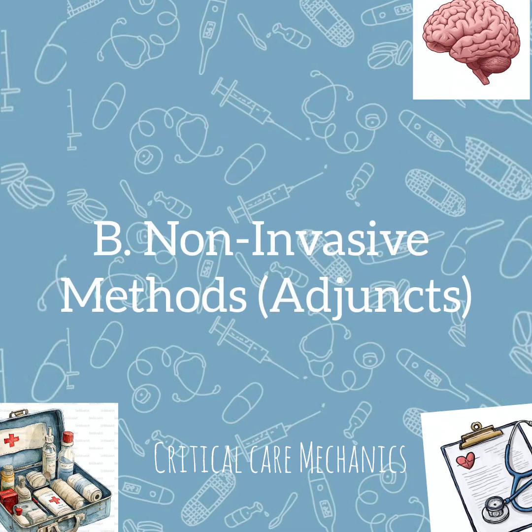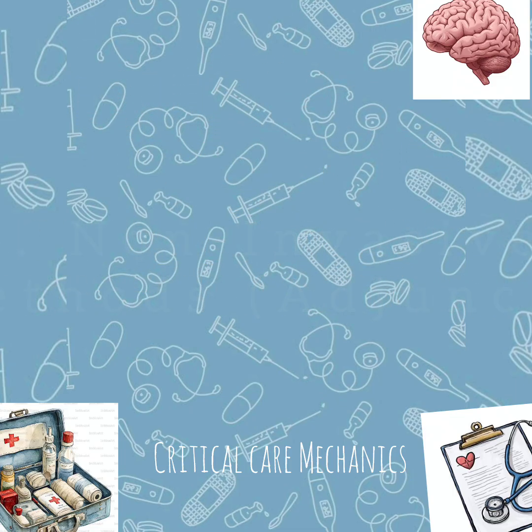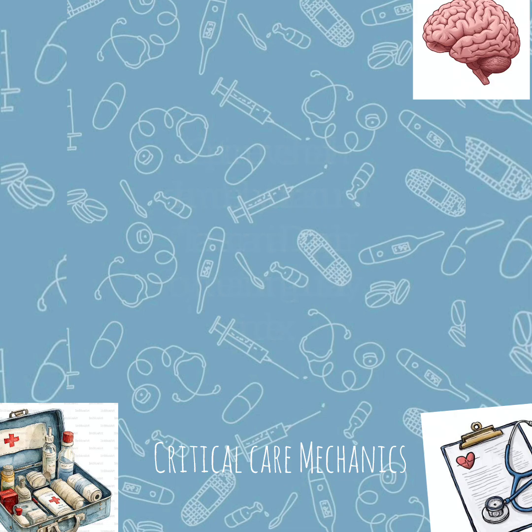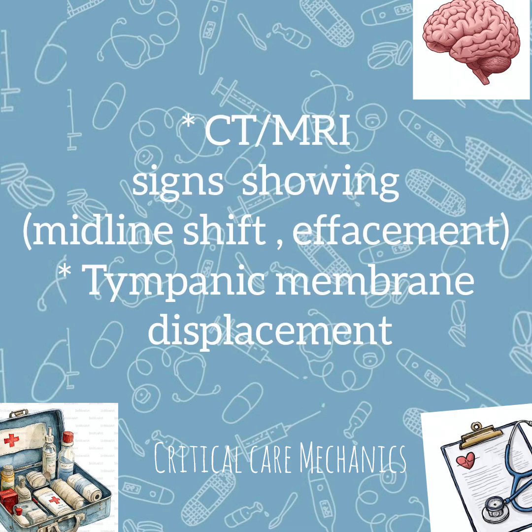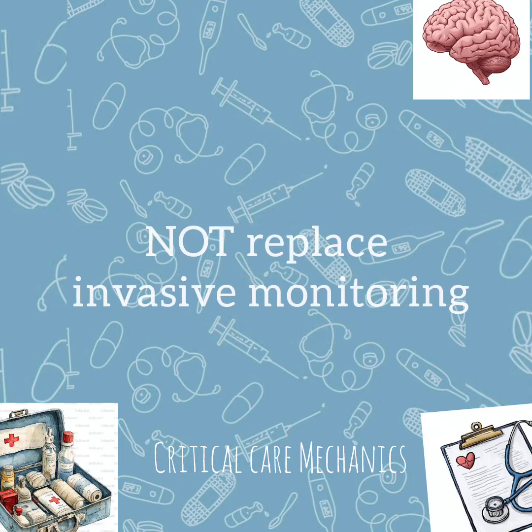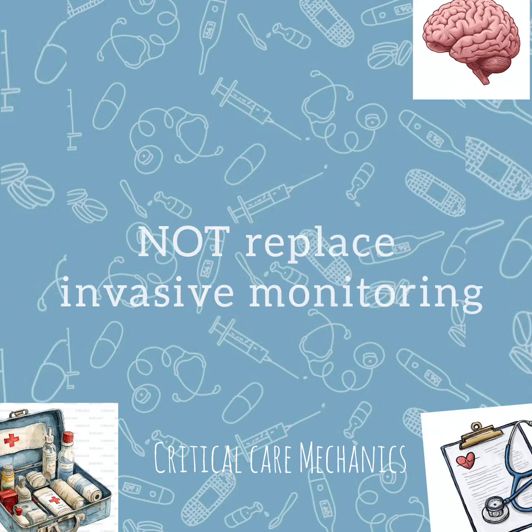B. Non-invasive methods, adjuncts: optic nerve sheath diameter by ultrasound, transcranial Doppler by measuring pulsatility index, CT and MRI signs showing midline shift and effacement, tympanic membrane displacement. The important point is that these do not replace invasive monitoring.